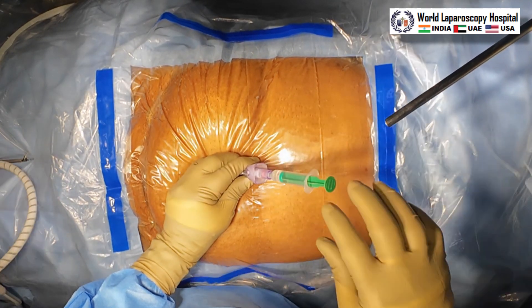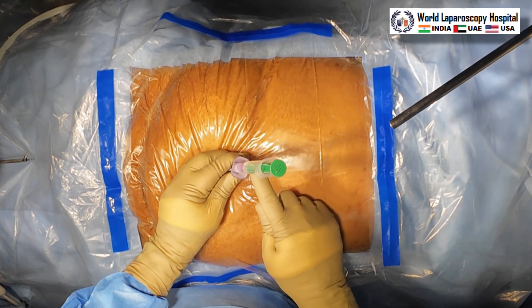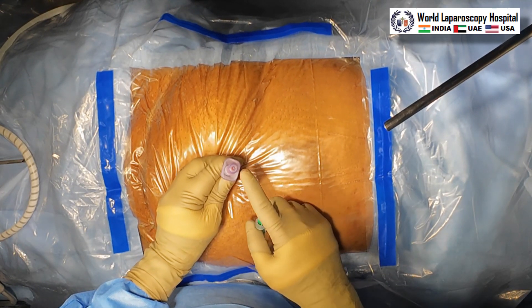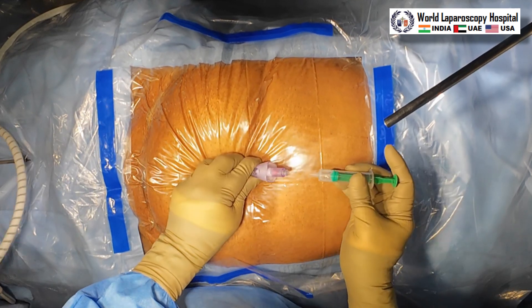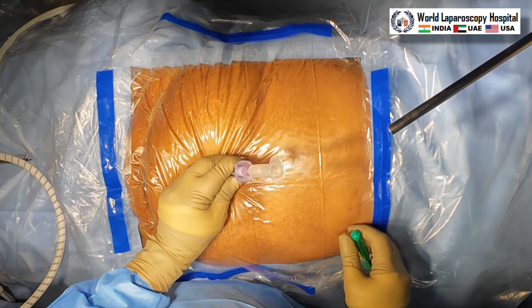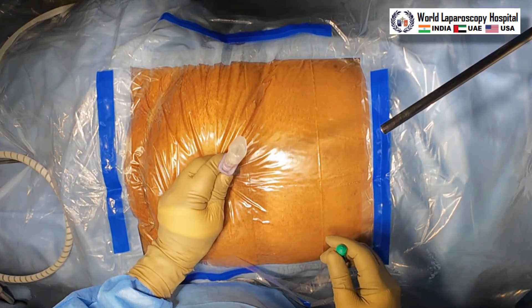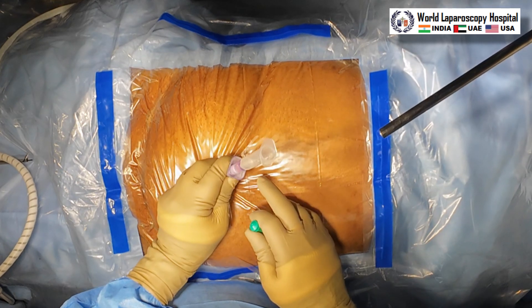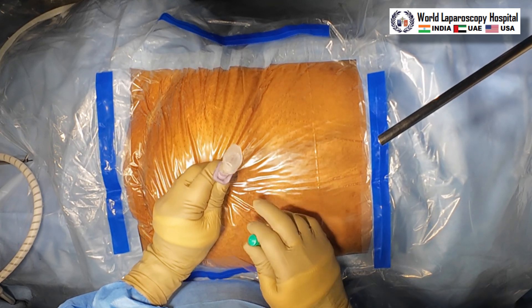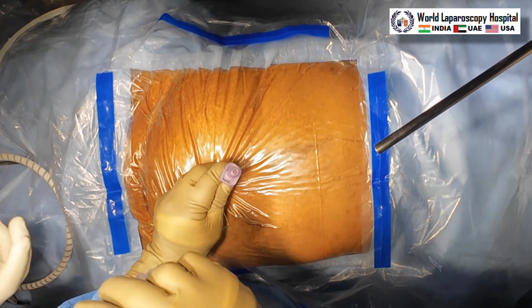This is the irrigation test — just a syringe with saline — and then suction: nothing is coming, only bubbles. You can see there is a ball in the disposable Veress needle by Johnson and Johnson, and this ball should sink down. That is just like a hanging drop test. Now this is the plunger test: we take the plunger of the syringe out and we can see the column of fluid in the syringe is sinking down. That is also a very good indicator to confirm you are inside the abdomen. We have done all the tests successfully; the syringe fluid has been sucked down because there is negative pressure inside the abdomen.